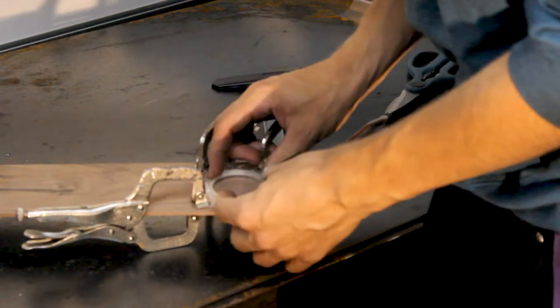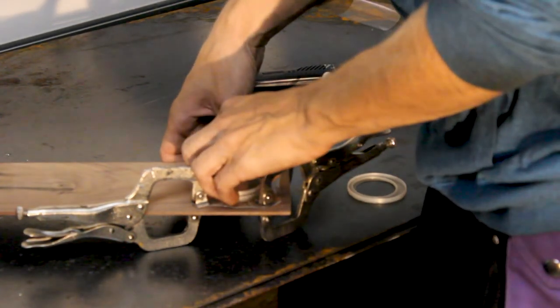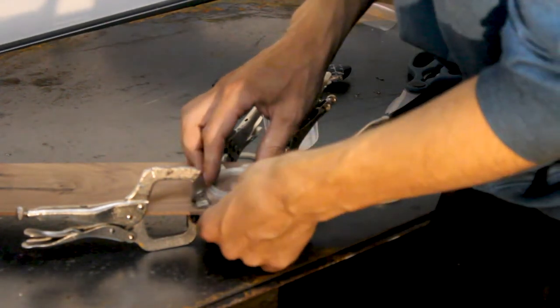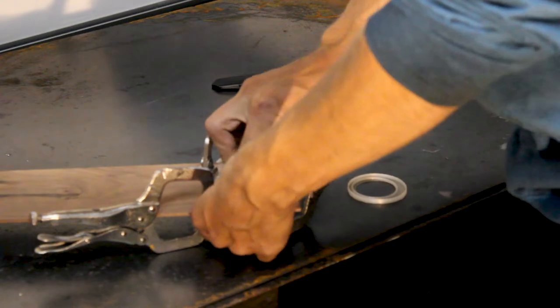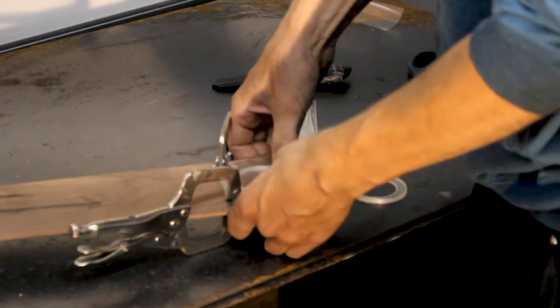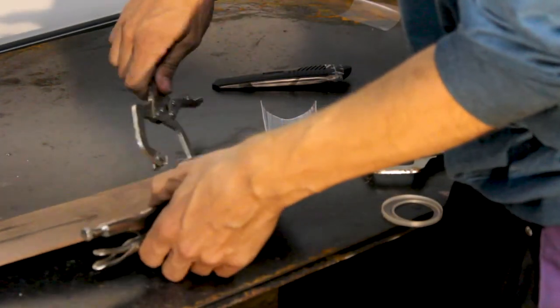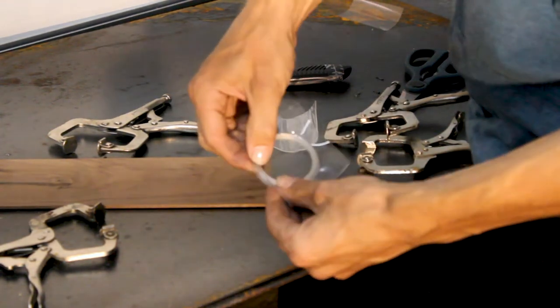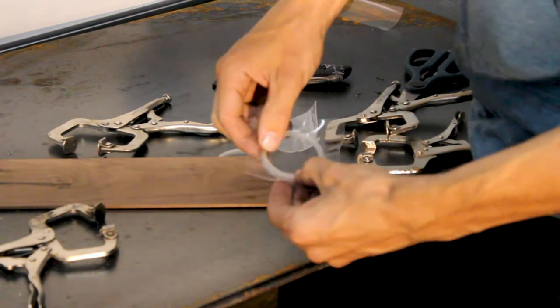And it's okay to go from one end to the other. Whatever you can do to get it in there, but just try not to slice off an edge by pressing too hard in any one area. Push it in a little harder, make sure it's in there good. Yeah, looks like it has a consistent edge.